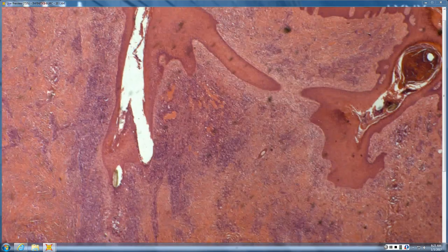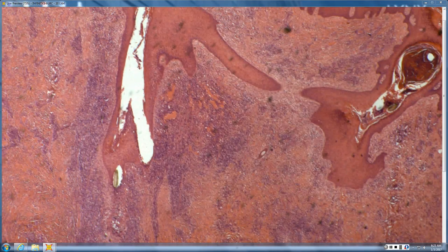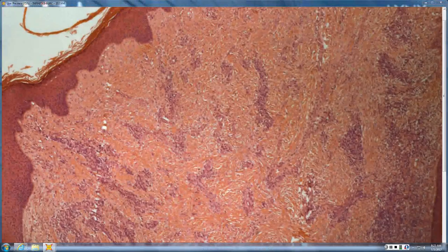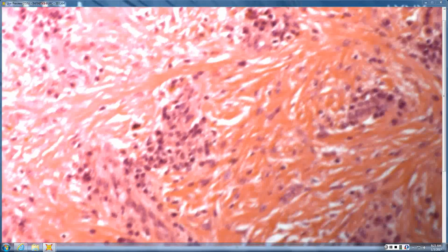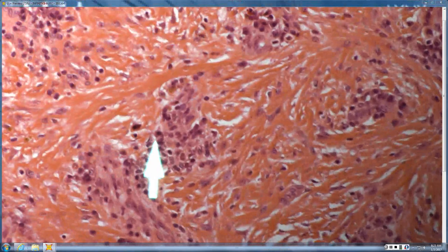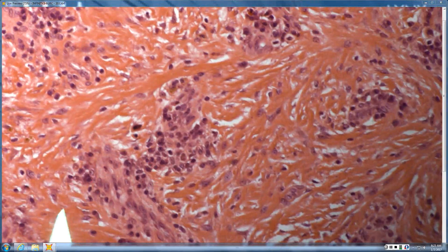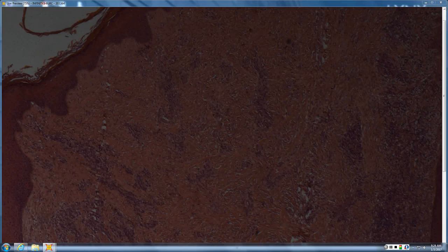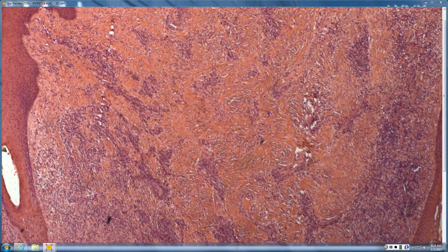So, a patchy dense infiltrate throughout the dermis. Is the dermis normal or not normal? It's definitely thickened. And the main perivascular inflammatory cell has a little clear perinuclear halo, an eccentric clock-face nucleus. Plasma cell. Lots of plasma cells. So scar, hypertrophic scar, plasma cells, folliculitis: acne keloidalis. Very good.